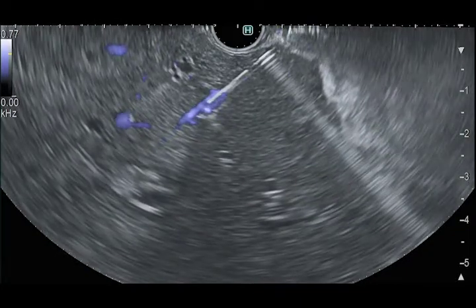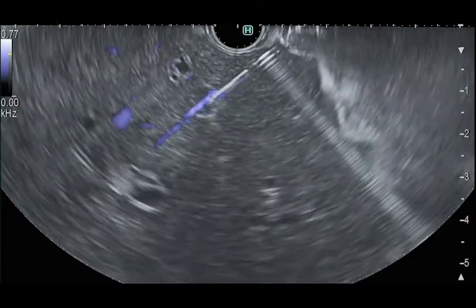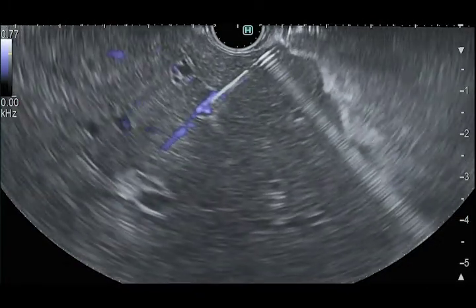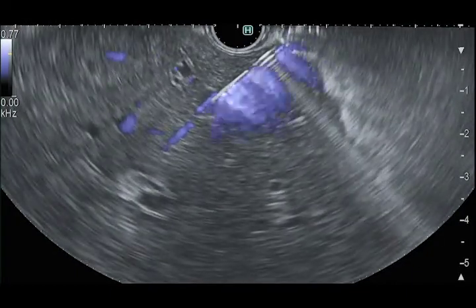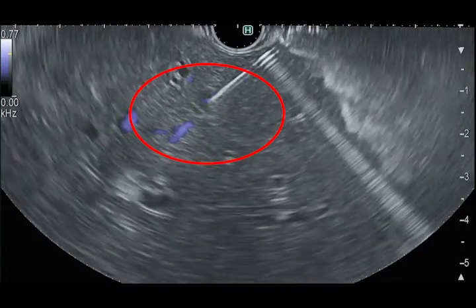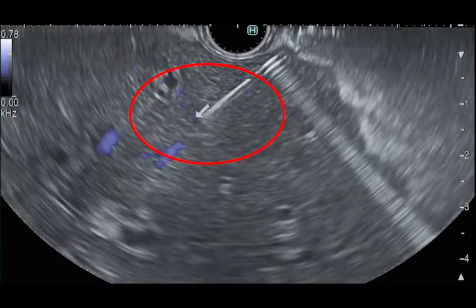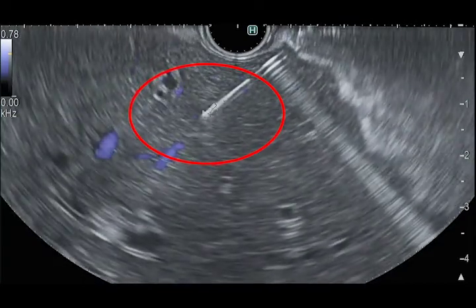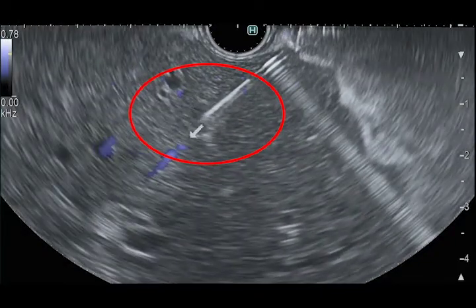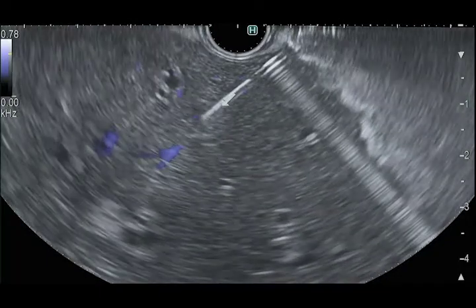At this point, we do not withdraw the needle further and wait two to three minutes for spontaneous hemostasis. If flow persists within our liver biopsy tract, we perform salvage with the blood patch technique. We introduce the stylet into the needle and deliver the distal 25% of the needle contents, which include mostly clotted blood. The hypoechoic material seen here represents our blood patch. The technique works successfully and flow no longer follows our needle as it is withdrawn from the liver.